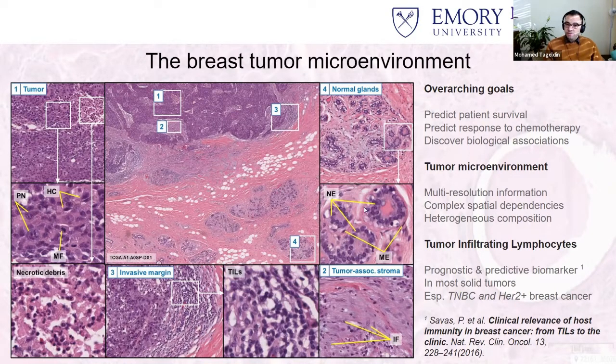So for example, if this is a normal breast acinus, then this gives context to calling this a normal epithelial nucleus, right? So this is normal epithelium, not only because of what it looks like at high power, but because of what it integrates into in terms of the context of what's surrounding it. There are various things that are even visually difficult for a human being if they're not trained. So that's why we have pathologists.